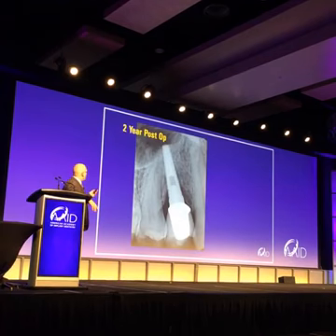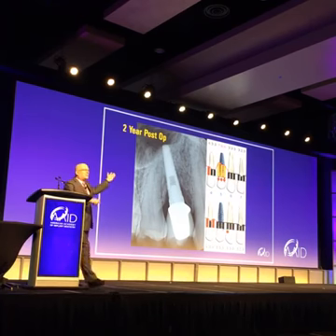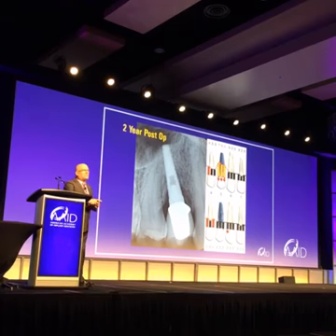2 years later, this is what he had, the bone came back. And you can see the pockets that were 15 millimeters are down to 3, and even the ones on the top, on the buccal, that were 15 millimeters are half. He got over a 50% reduction in pocket depth with one treatment. And he got the bone to come back around the implant.